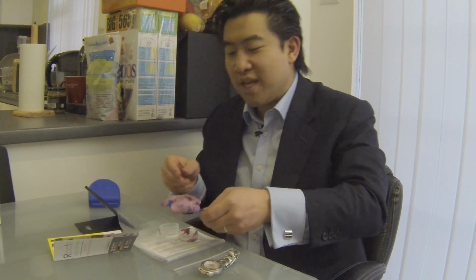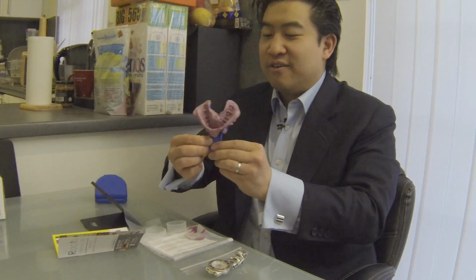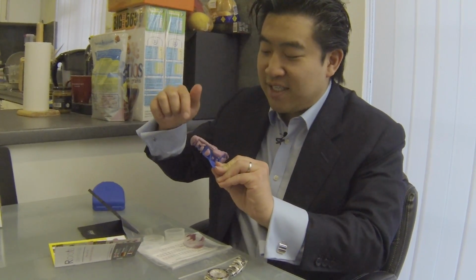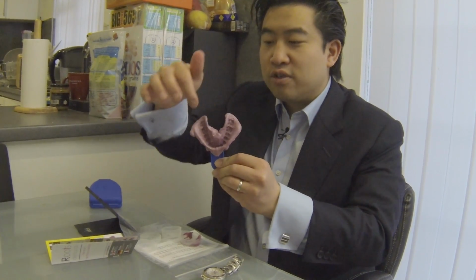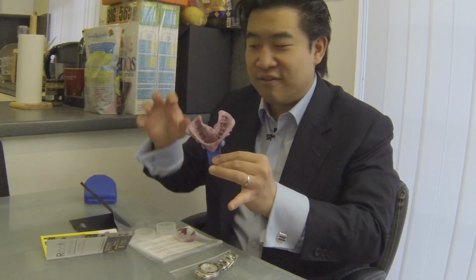Oh. And there we have it. My teeth impressions, all in this tray. Now you can see there are some holes where it's touched the guard, but once they actually make the guard, those holes won't be there. They kind of make it thicker and things like that. It looks kind of gross, a bit rank at the moment.